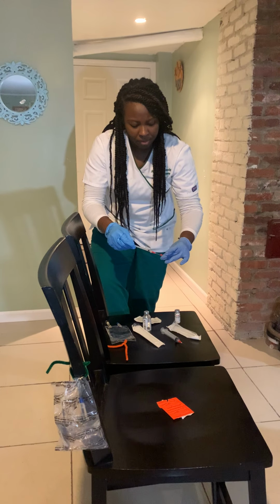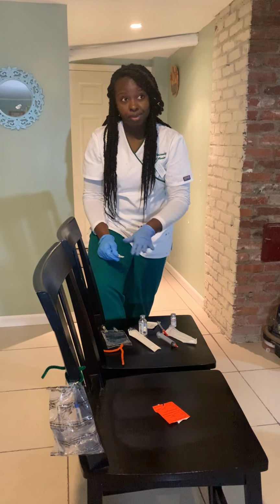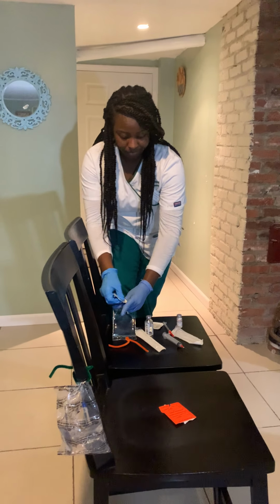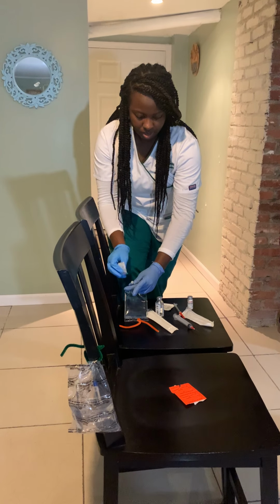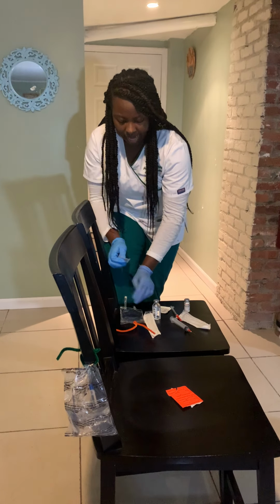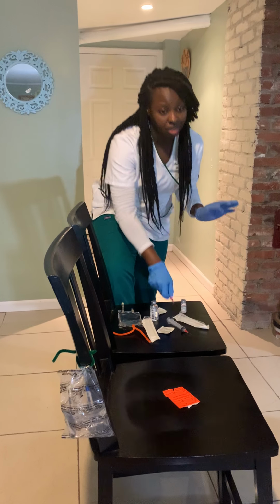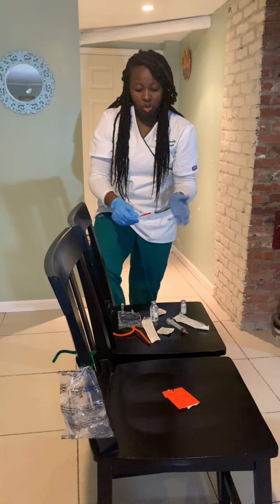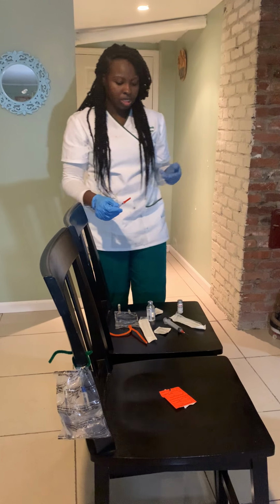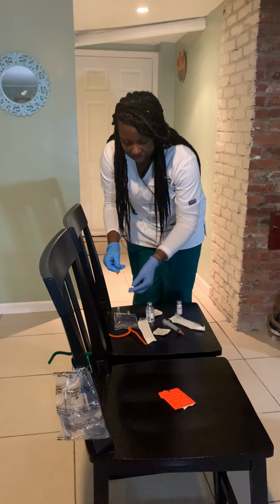Now I'm going to perform another aseptic technique, which is to clean off the IV piggyback port. I'm going to clean the white part, making sure it's nice and clean, and this is on a nice flat surface. I'm going to then uncap my medication, doing one final check to make sure it's the right patient, time, medication, dose, and frequency. And I'm going to insert it into the port.